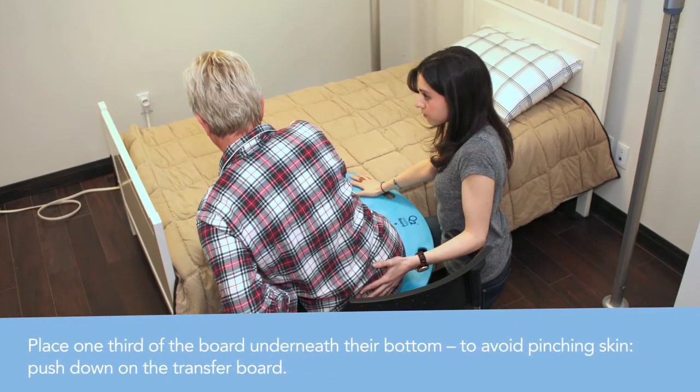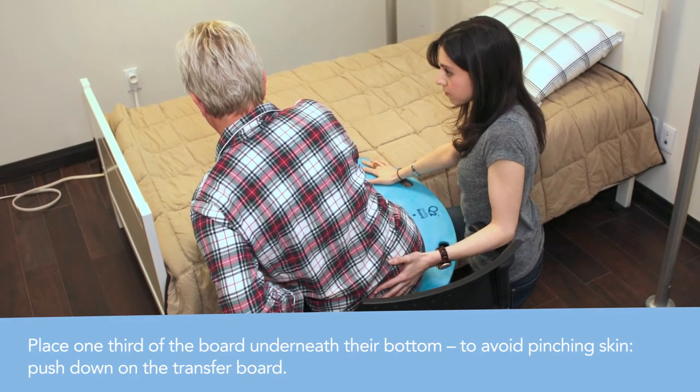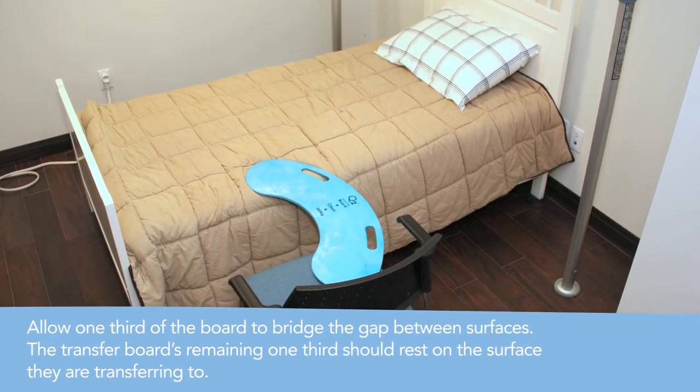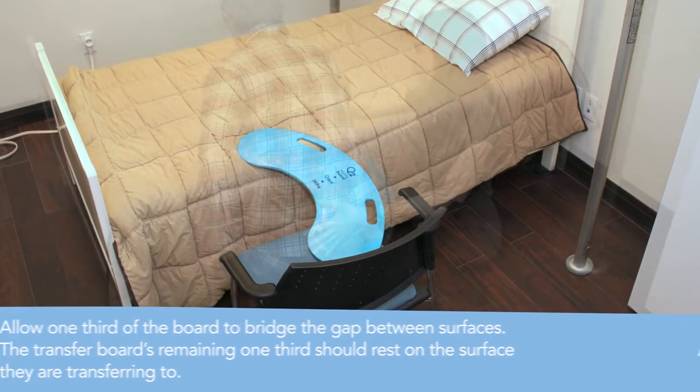Placing one-third of the board beneath the person's bottom — to avoid pinching the skin — push down on the transfer board. Allow one-third of the board to bridge the gap between the surfaces. The transfer board's remaining one-third should rest on the surface they are being transferred to.